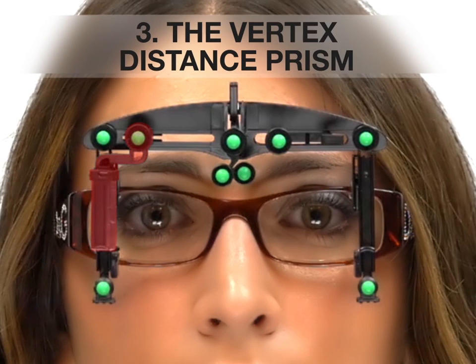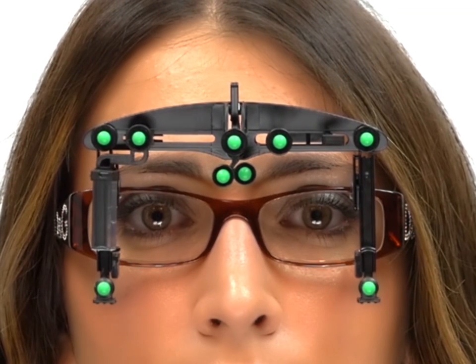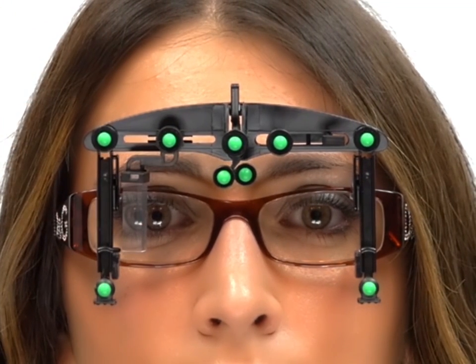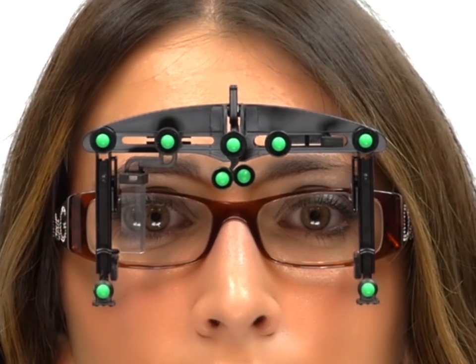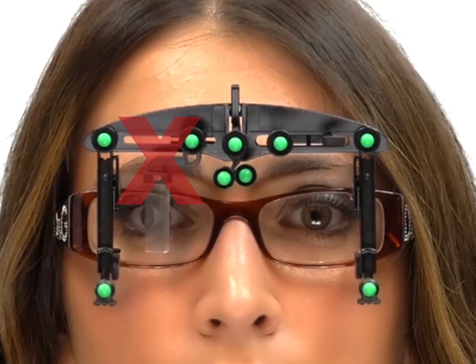The vertex distance prism can be moved left and right by applying a light pressure on the thumb rest. Place yourself nose to nose with the patient and simply move the prism to the temporal side of the iris until the pupil is visible inside the prism. Also, make sure that the prism is not obstructing the frontal view of the patient's pupil.